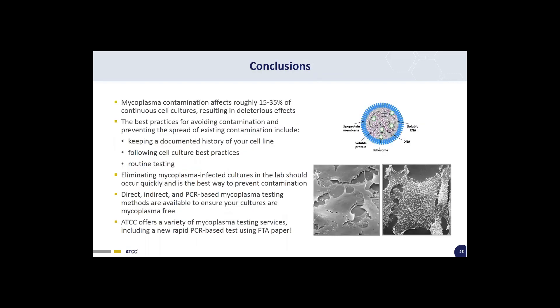In conclusion, mycoplasma contamination affects roughly 15 to 35 percent of continuous cultures and can result in deleterious effects. Best practices for avoiding contamination include keeping a documented history of your cell line, following cell culture best practices, and always performing routine testing using the methods discussed today. Eliminating mycoplasma-infected cultures quickly is always the best way to prevent further contamination. Direct, indirect, and PCR-based mycoplasma testing methods are available, and ATCC offers a variety of mycoplasma testing services, including a new rapid PCR-based test using FTA paper.